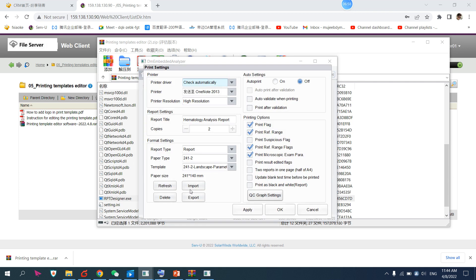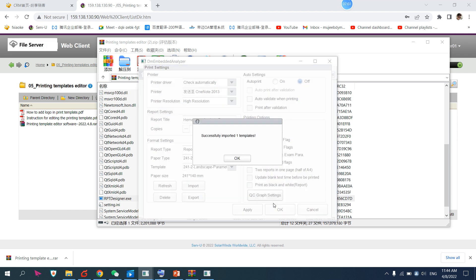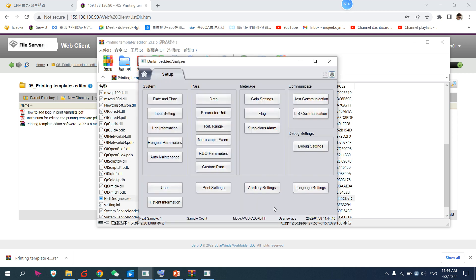Import the file you already fixed. I have these files — for example, I want to import '111111'. Open it — it's successfully imported. Then you have to refresh it. After refreshing, you can use that template. I have the demo software here. Thank you.